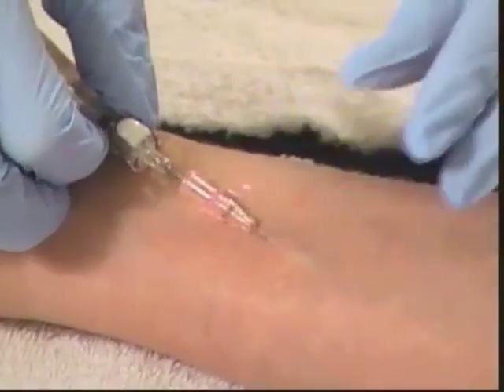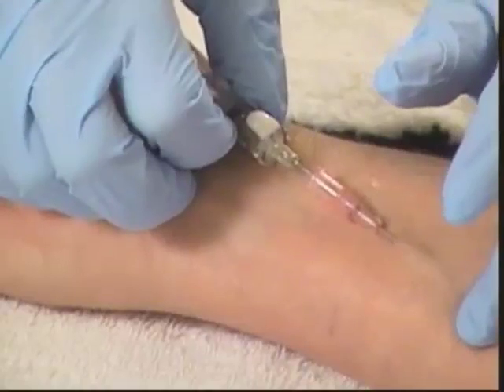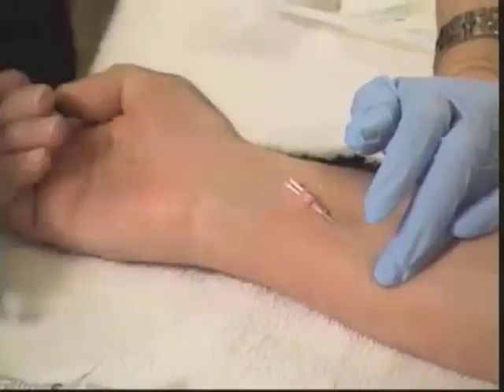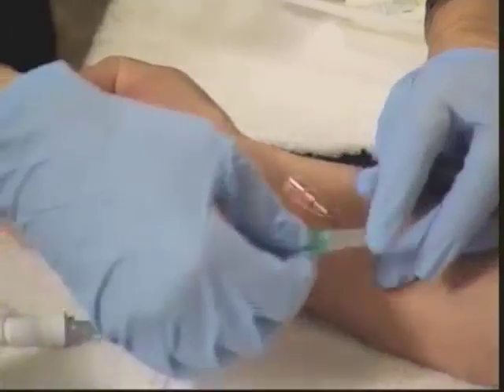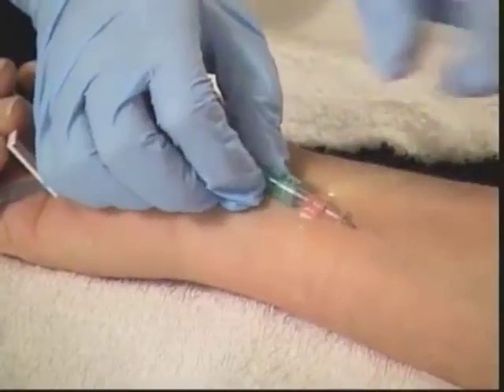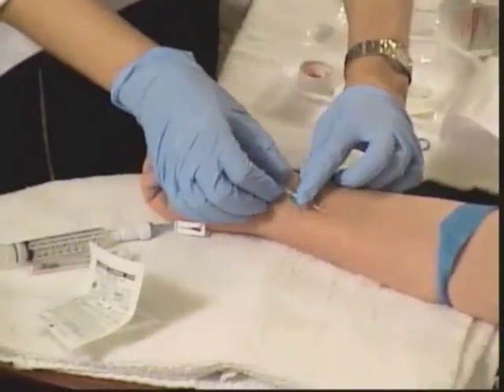The skin is a little bit tough, so I'm not going to force it. I'm going to release the tourniquet and put pressure right over the vein so that when I take the needle out, blood doesn't ooze out. I'm going to retract the needle back and push the safety button so there's no danger of a needle stick. Then I'll reach for my extension tubing, keep pressure here, and luer lock it onto the hub. Once that's connected, it's okay to let the pressure off the vein because it's not going to leak anymore. Flush with two to three milliliters of saline at a minimum.